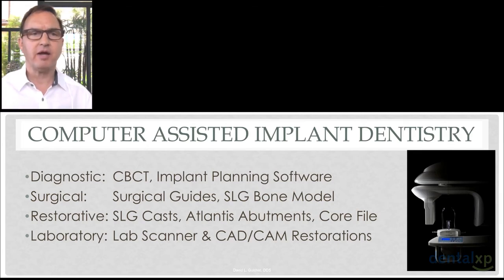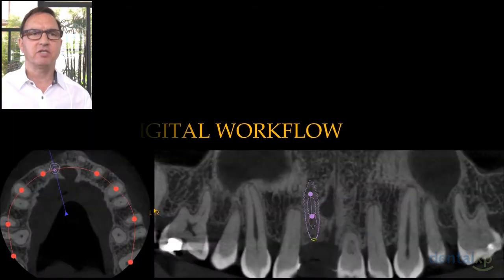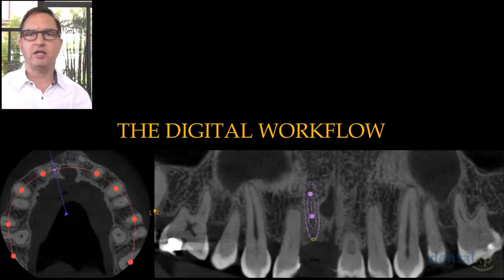So what I'm talking about is really realizing and creating a digitally based practice philosophy. It's not digital for the sake of digital, it's digital to take advantage of the strength that this new technology provides us to be most efficient. So one of the entry points into the digital workflow is the cone beam.